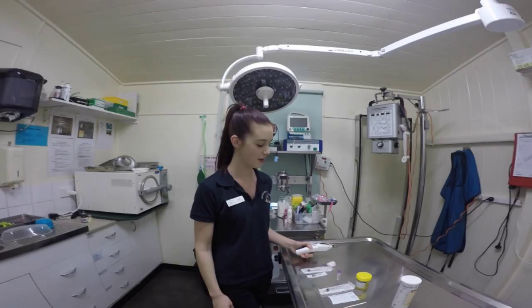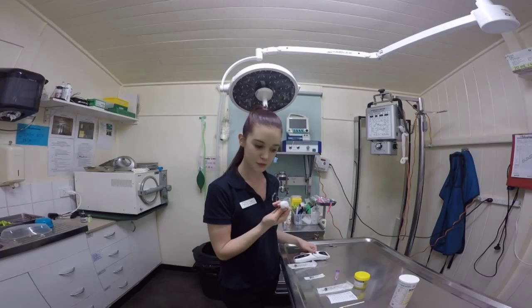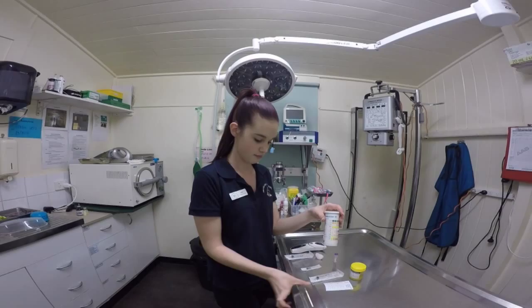For the blood collection I will need clippers to trim the fur, a 3ml syringe, a 22 gauge needle, an alcohol cotton wool ball, and an EDTA tube to maintain cell morphology. For the urinalysis I will need a 3ml syringe, a dipstick, a sample of urine, and a nearby sink.